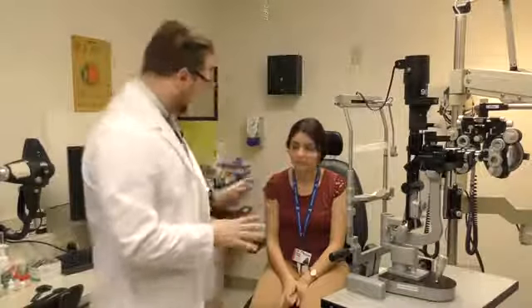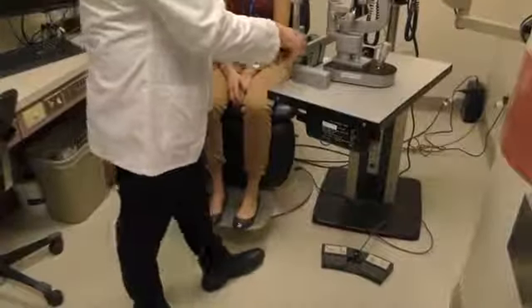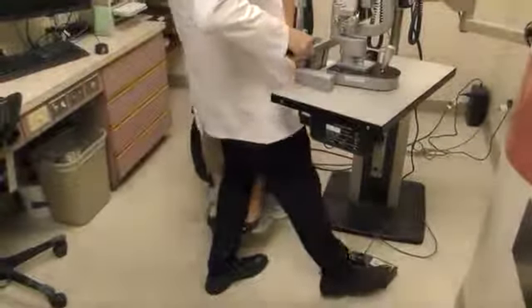Then what you want to do is use the pedals on the ground to lift or lower the chair. There's pedals here. You can push on them to make the chair go up or make the chair go down. Just make sure that the patient's at a good position. There are also different buttons on the pedals where you can make the chair go back when you're doing your fundus examination. Okay, so we'll put them.